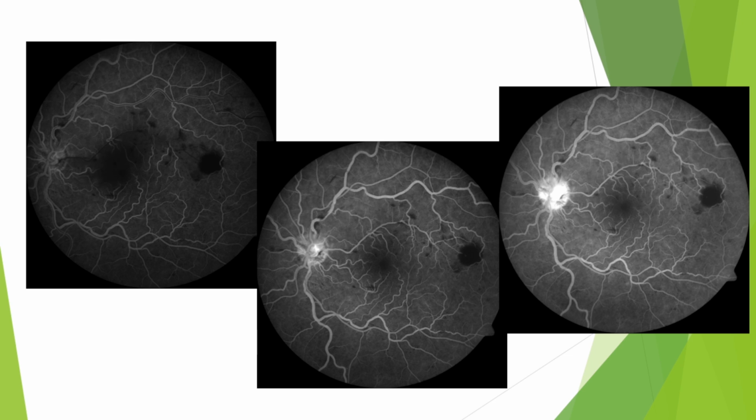We can see it is an early arteriovenous image showing dilated tortuous veins with blocked choroidal and retinal fluorescence. What is that dark line coming from the disc onto the macula? Is it an artifact or something else? There is one dark line in the papillomacular bundle going from the disc towards the macula, curving up across the fovea.